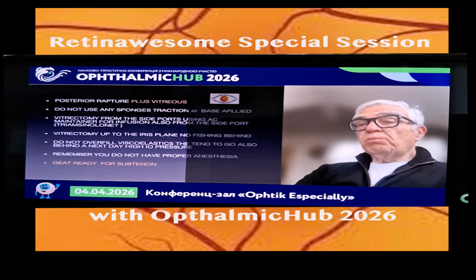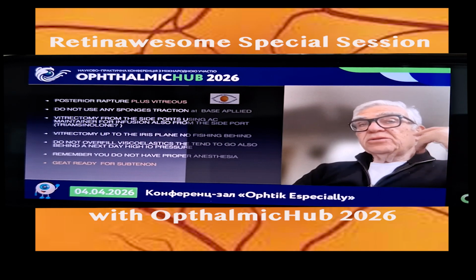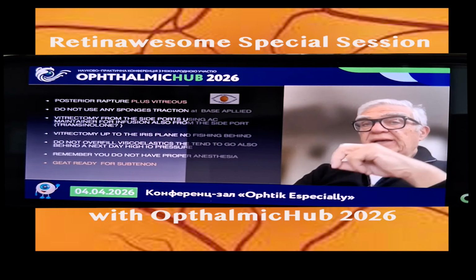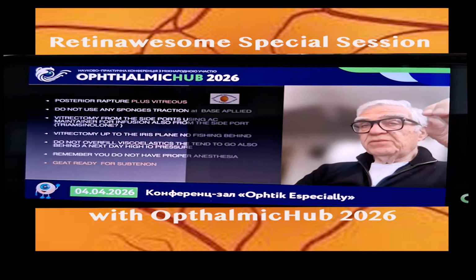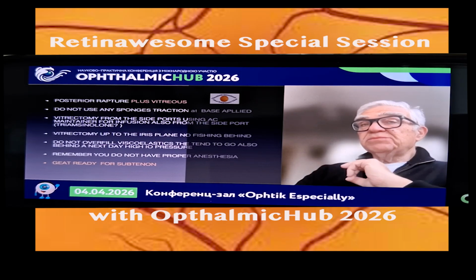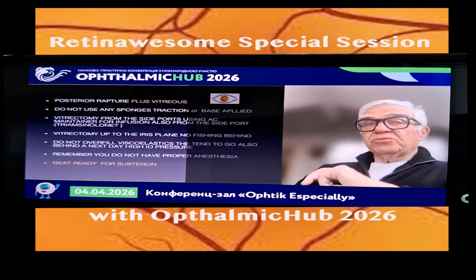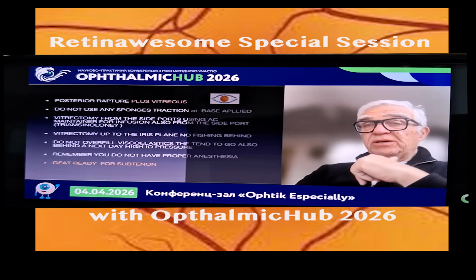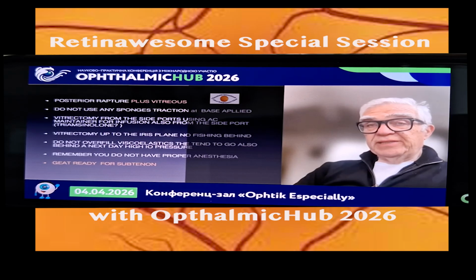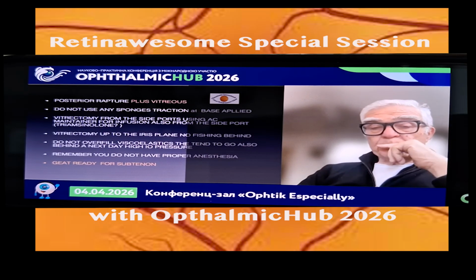What is posterior rupture plus vitreous loss? Another thing that people usually used to do is to put sponges and cut the vitreous with sponges, lifting from the cornea. That means the traction is particularly done at the base of the vitreous, and they do the damage later, many months, a year, 2 years later, because of the traction at the posterior base. That means tears.